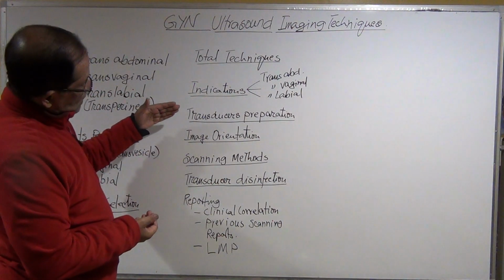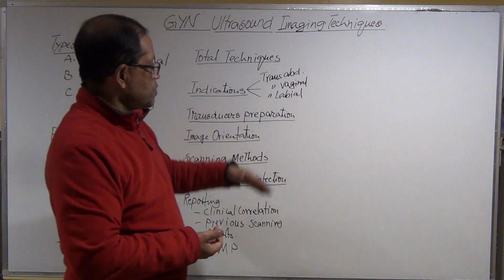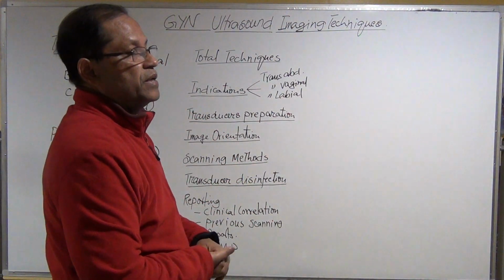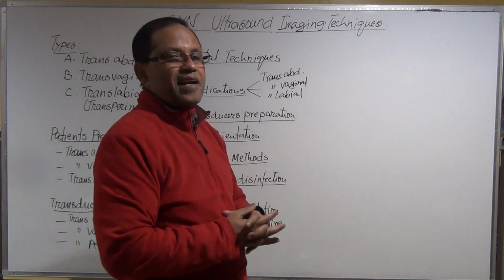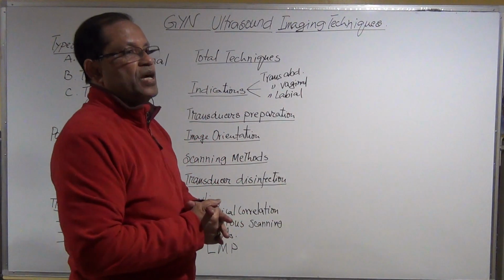Then we will study the transducer preparation. Transducer needs to be prepared because some transducers go inside the birth canal, and there are a lot of germs over there.